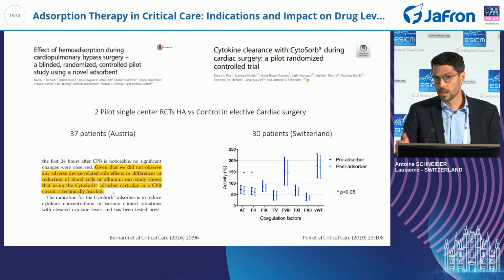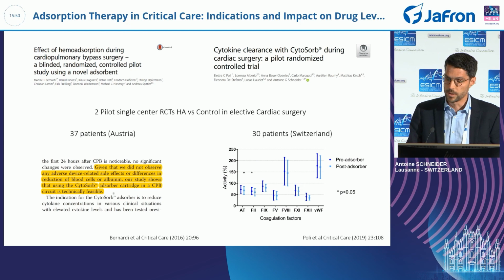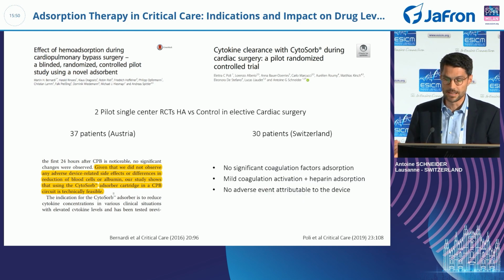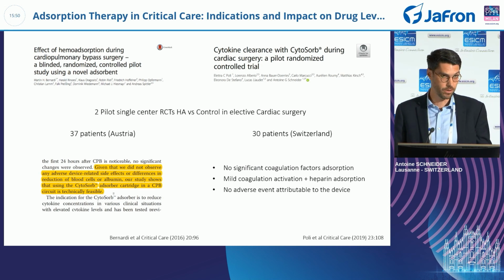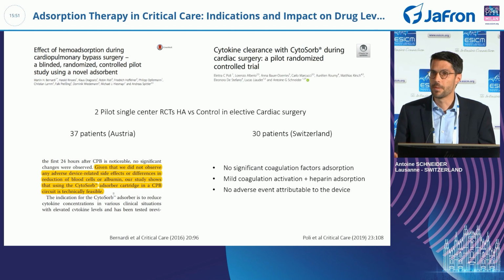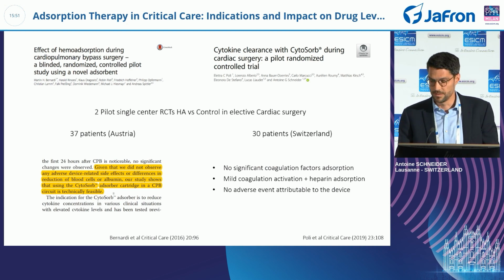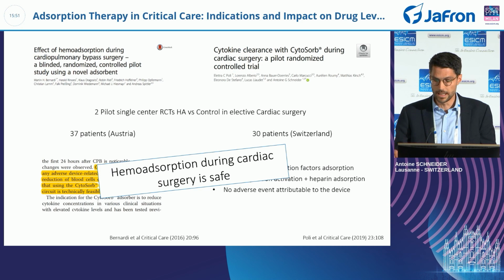In particular, in our center, we focused on the coagulation parameters, and we did not find any significant adsorption, removal, or clearance of coagulation factors. There was a mild activation of coagulation and a mild heparin adsorption. But certainly in none of these trials were there adverse events attributable to the device. So it's feasible and it's safe.